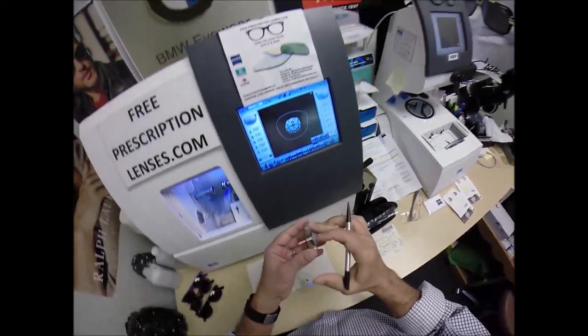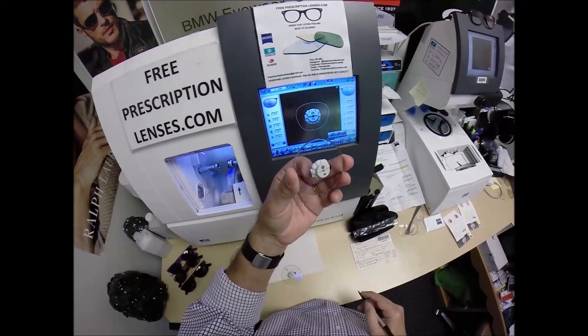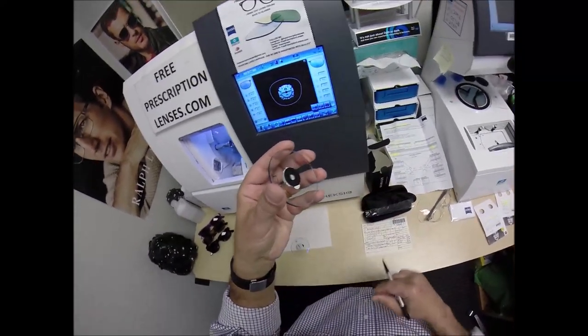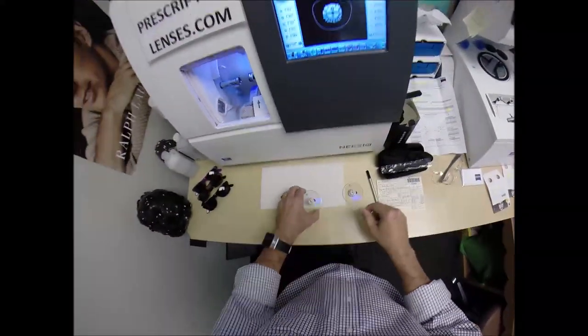I'm not going to put a safety bevel on the front convex surface of the lens because I'm a bad boy. I'm just a rebel. I'm not going to do it. But I am going to put one on the rear concave surface of the lens because at the end of the day, I'm just a big softy. And I'm going to put a safety bevel there, whether it deserves one or not.